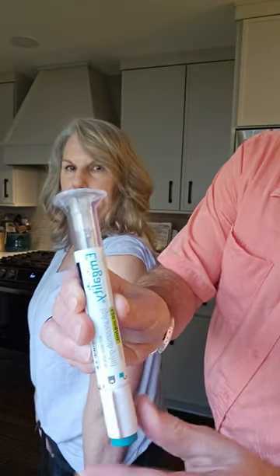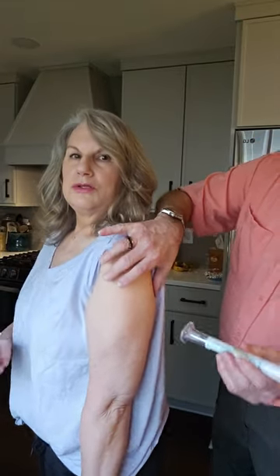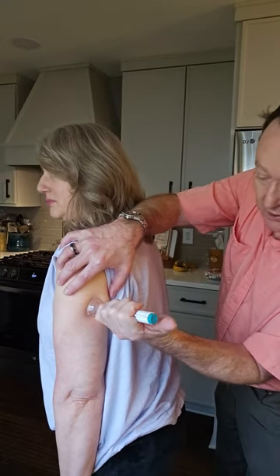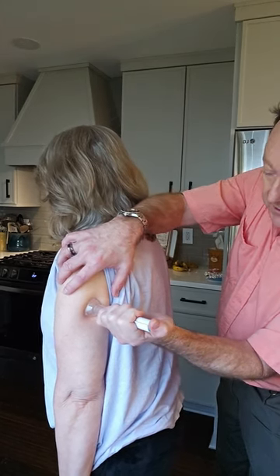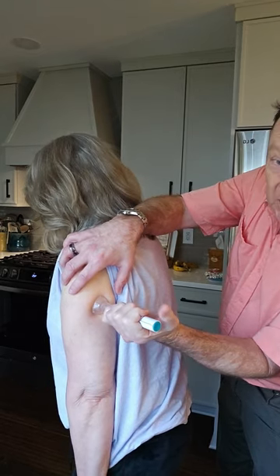You see the locked, unlocked. So we're going to unlock it. Then we're going to get ready. Do you have to push anything? Yes. Explain about that. You have this green button back here. So you place this up against the skin gently. 5, 4, 3, 2, 1. Press and you hold the button in. And when you let go, when it's done administering, it will automatically retract the needle.